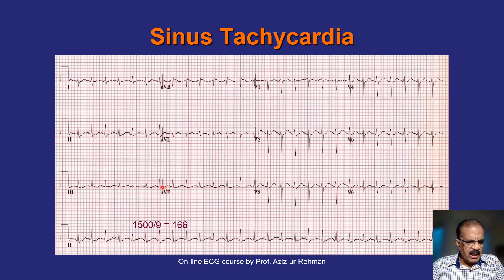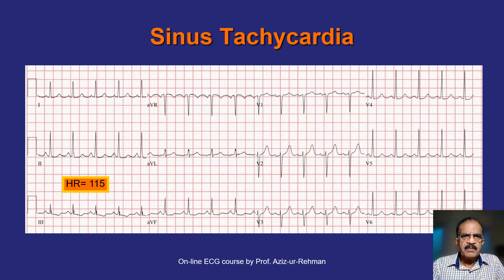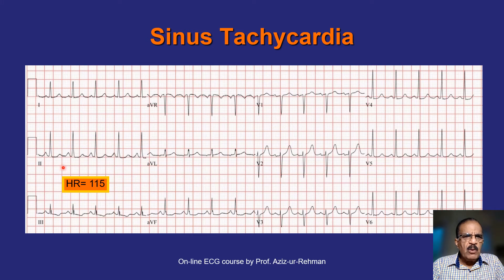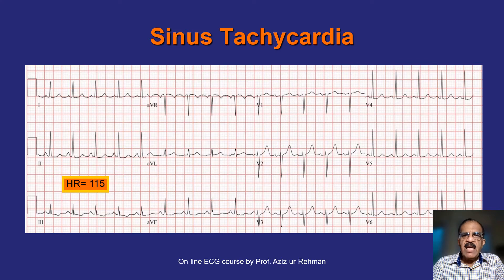Here is another example of sinus tachycardia. The heart rate calculated is 115 beats per minute. You can see absolutely regular PQRS complexes throughout. This is another example of sinus tachycardia — the heart rate is lower, though by definition any rate more than 100 is tachycardia.